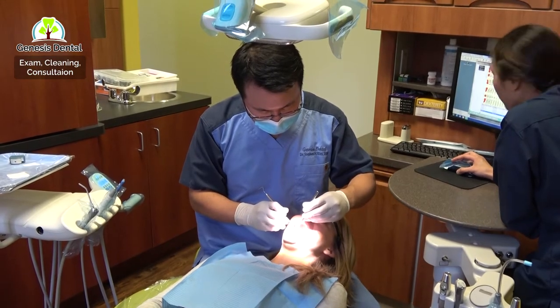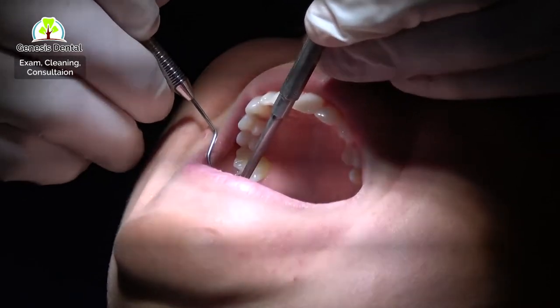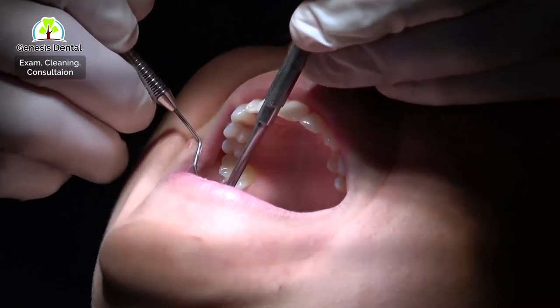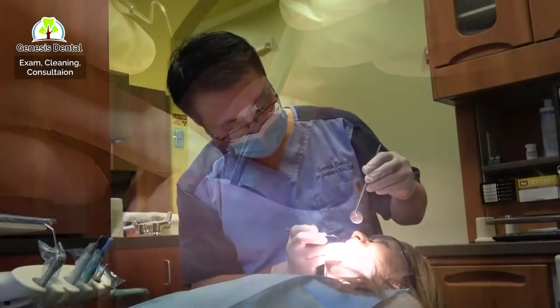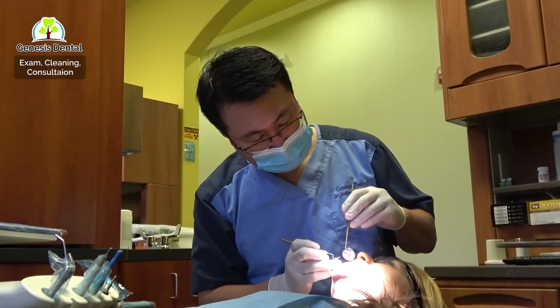This is a little sticky. The tooth actually is missing. It's a little soft. If I can stick it, that may be something going on there. I had bonding done and it chipped off recently.